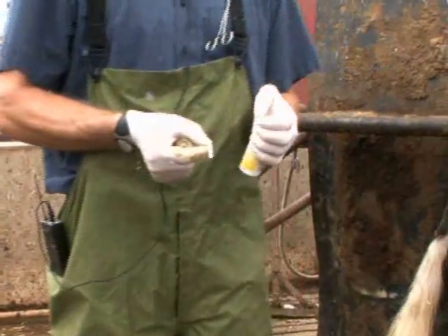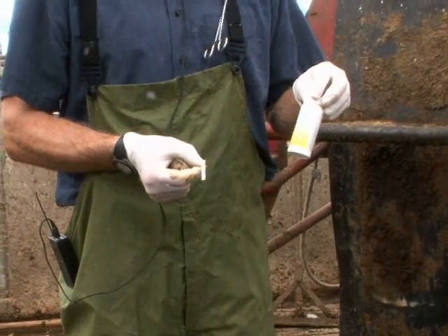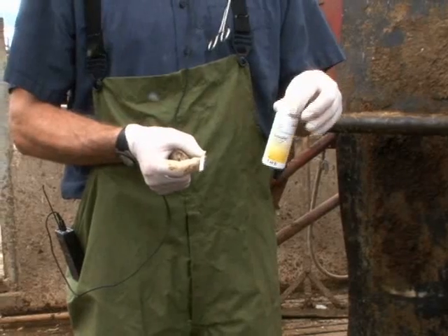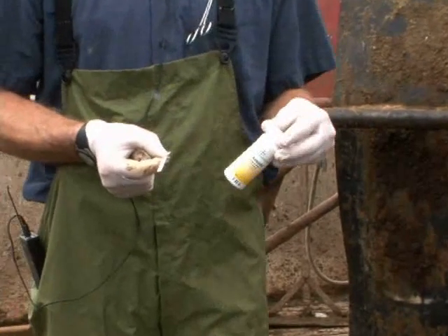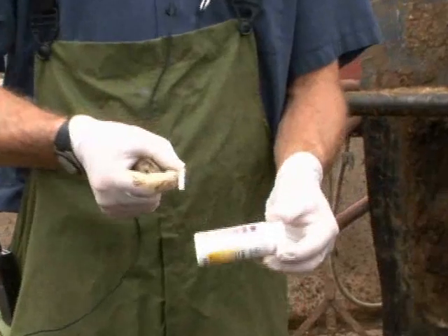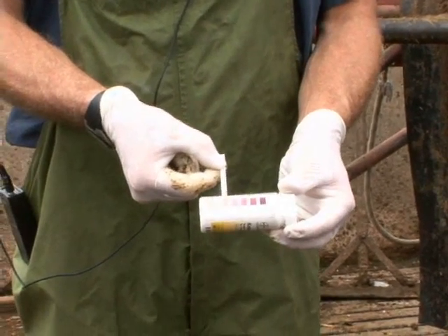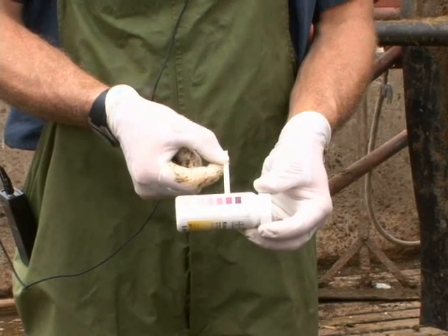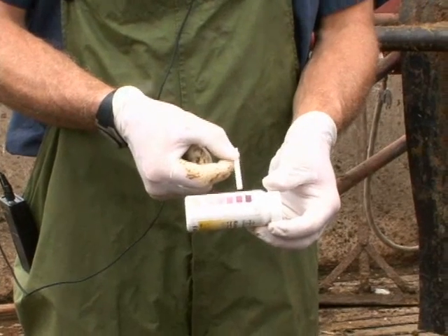Once the urine sample is collected, we read the sample. This particular test is a keto stick, and it requires exactly 15 seconds for the reagent to react to any ketone bodies that may be concentrating in the urine. We compare the keto stick to the different color gradients — the darker or more purple the color goes, the higher the level of ketone bodies in these cattle.